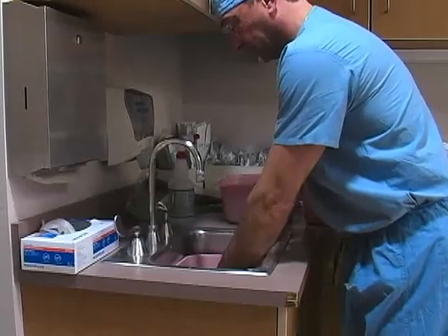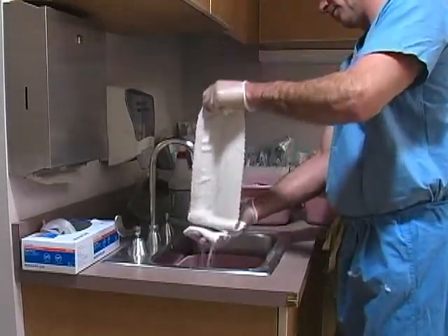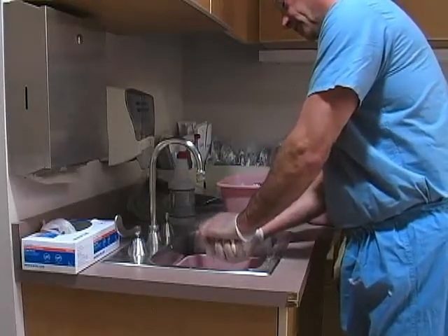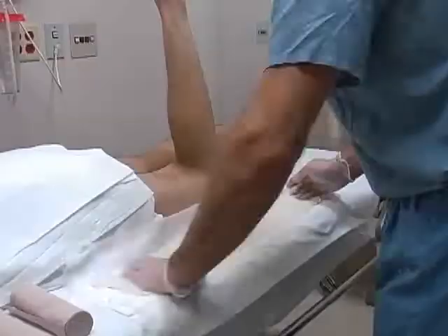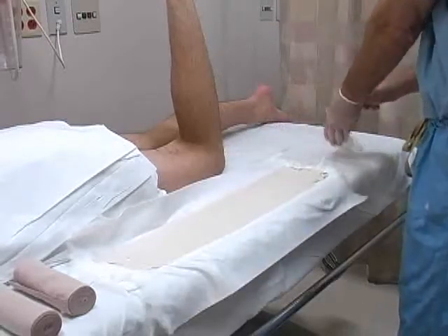Soak the plaster in room temperature water until fully saturated. Raise the plaster from the bucket and remove the excess water by allowing the layers to gently fold on themselves and then gently squeezing them. Lay the plaster down onto the cast padding and smooth it over with your hands.